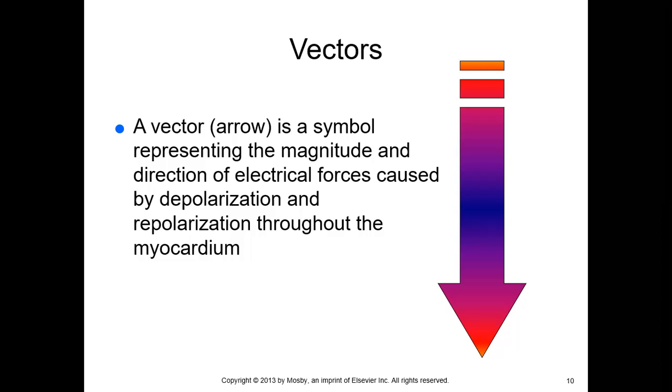What exactly is a vector? A vector is a symbol representing the magnitude and the direction of an electrical force caused by depolarization and repolarization through the myocardium.